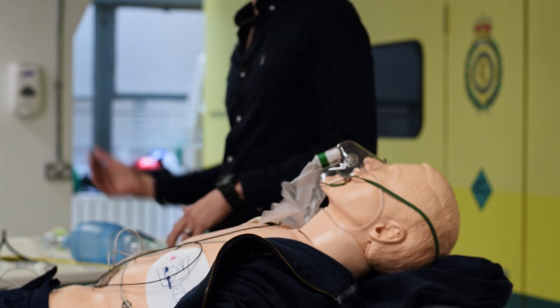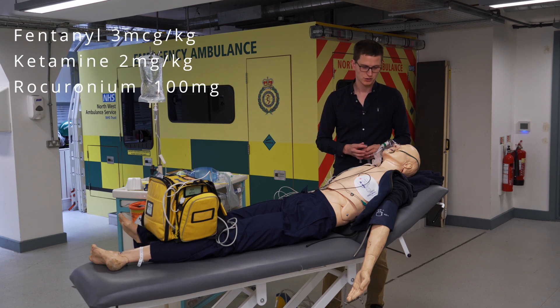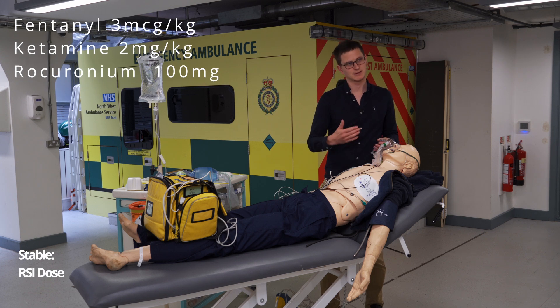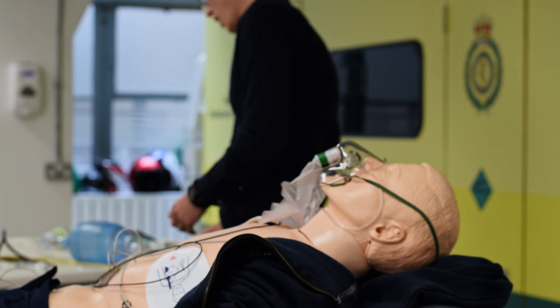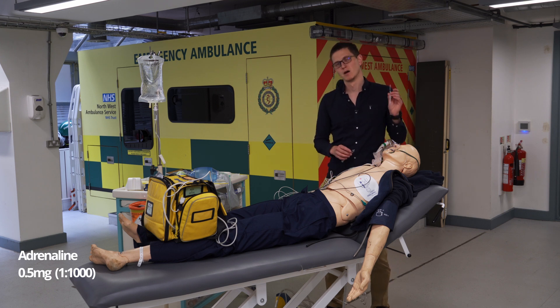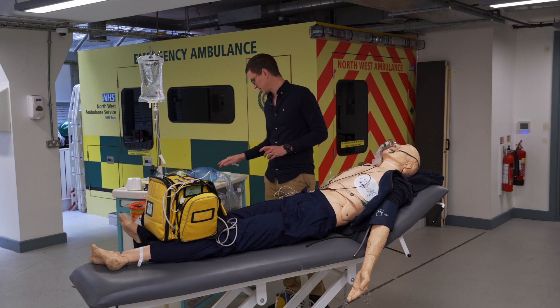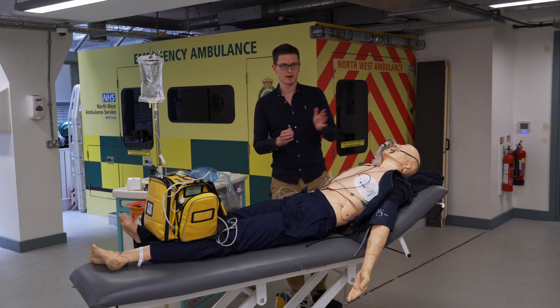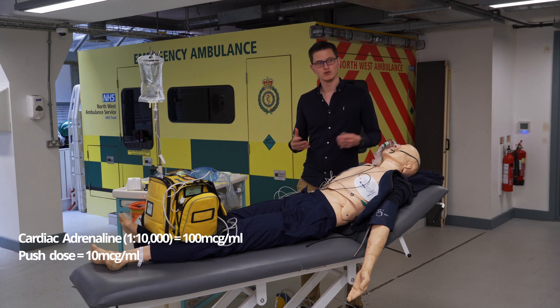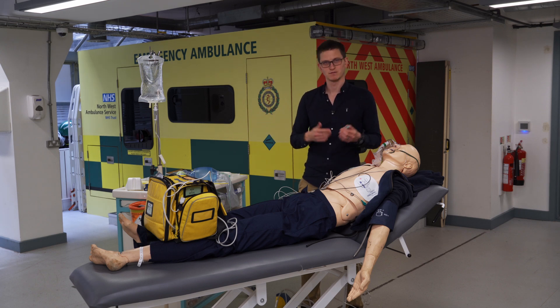Now our equipment and medication: we have the sedation, the analgesia, and the paralytic. Ketamine at 2 milligrams per kilogram — so 160 milligrams. Fentanyl at 3 micrograms per kilogram — so 240 micrograms. And then ROC, which is just 100 of ROC. We also have 0.5 milligrams of adrenaline in a 1-in-1000 solution drawn up for anaphylaxis — already labeled and ready to give IM. And we have a push dose presser: 5 to 10 micrograms per push. To make it up, use a 200 ml bag with 2 amps, or a 500 ml bag with 5 amps, then draw out 5 to 10 mls — that's your push dose presser. All medications should be labeled.